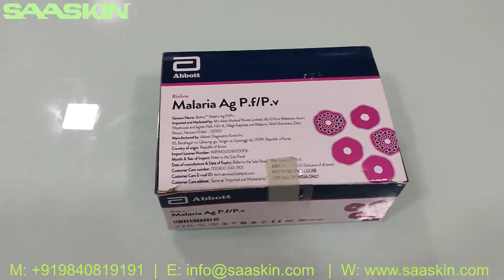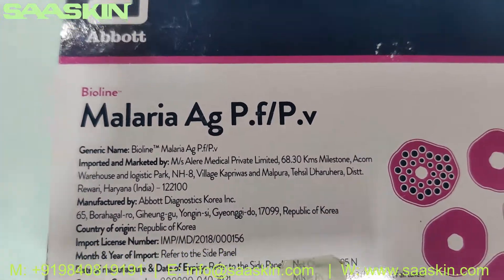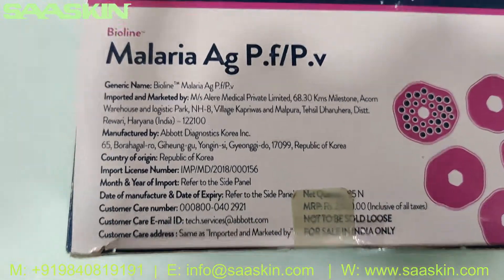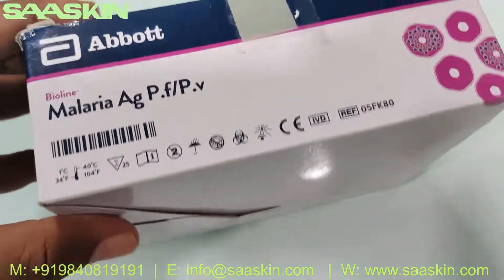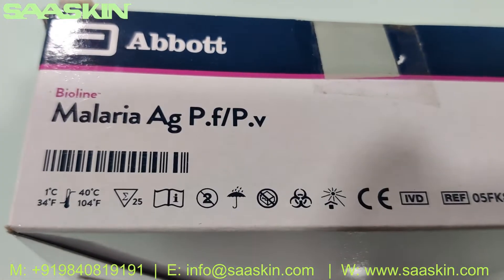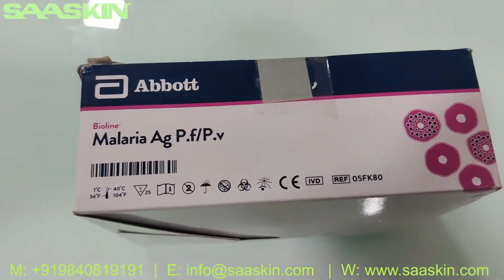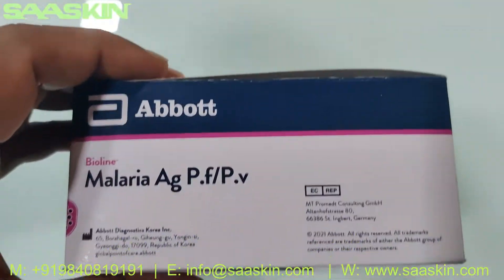Today we're going to see the unboxing of the Abbott Bioline Malaria Antigen PF/PV test kit. This is from the Abbott brand, manufactured in Korea. The box is CE-certified, you can see the temperature range that can be maintained, it's a 25-test kit pack. You can also see the reference part number on the box.